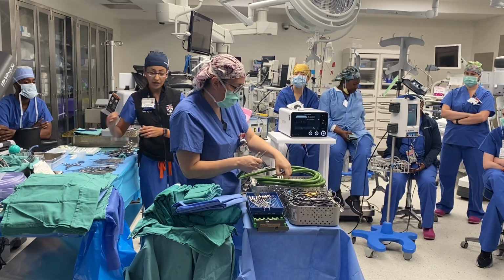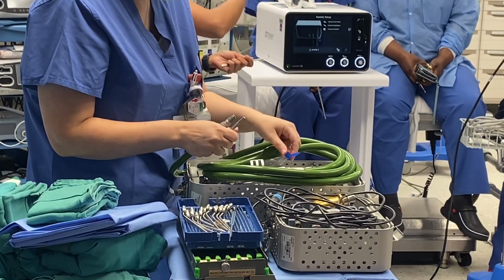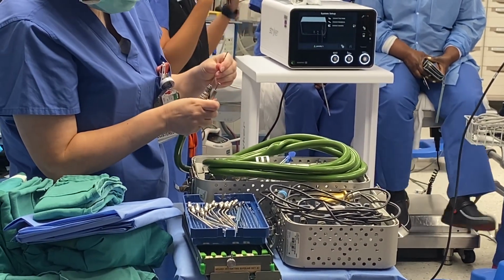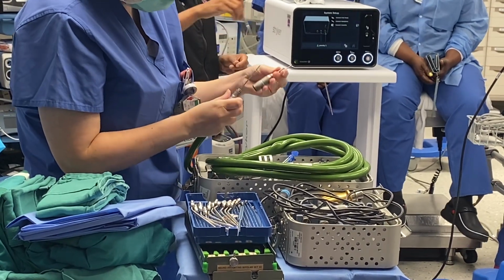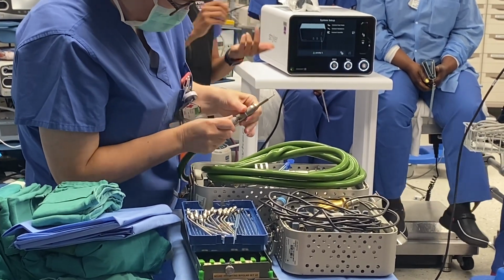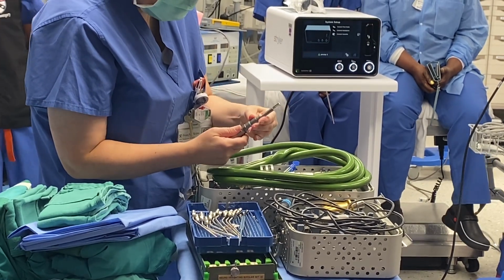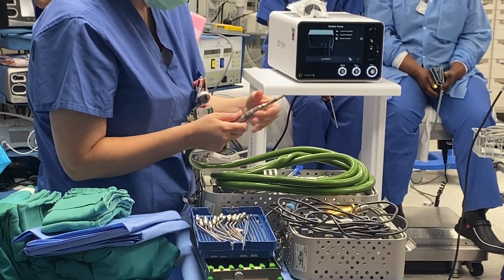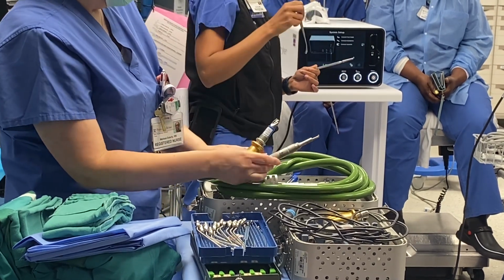And then sequentially, in all of us, our skull and what's called the dura, which is the covering of the brain, are very, very close together. They're very tight in healthy brains, especially so in people who have big bleeds in their head. So we will use elevators to separate the skull from that dura. And this is a Fraser right angle, so we'll typically use something like this. We'll also use the Penfield 3. Penfield 3 has that nice curve to it. So we'll work through the burr holes that we made to do all of that dissection.